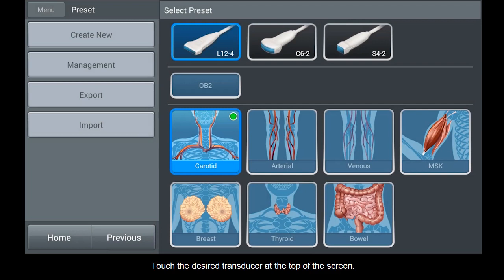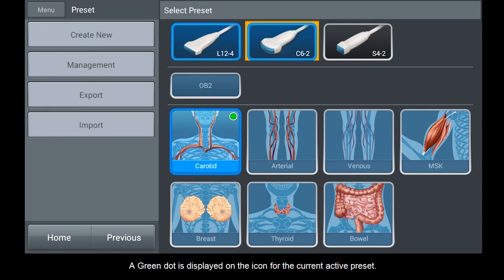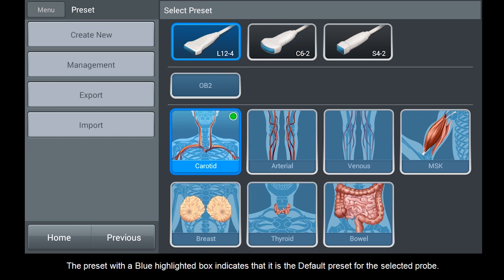Touch the desired transducer at the top of the screen. A green dot is displayed on the icon for the current active preset. The preset with the blue highlighted box indicates that it is the default preset for the selected probe.